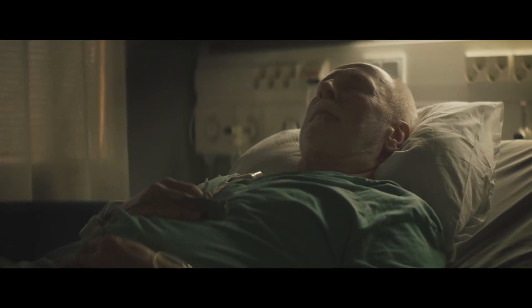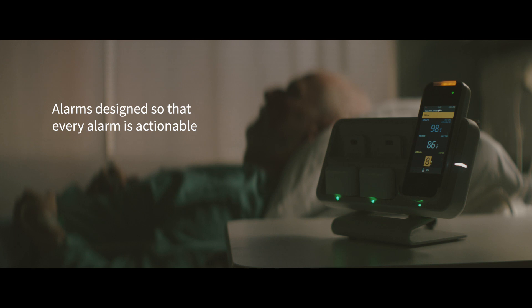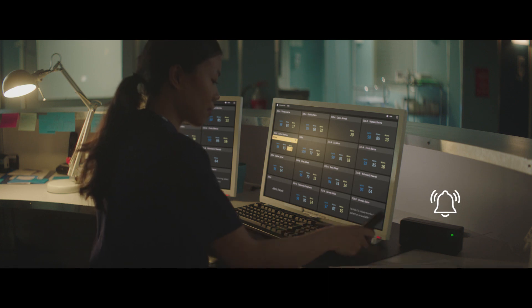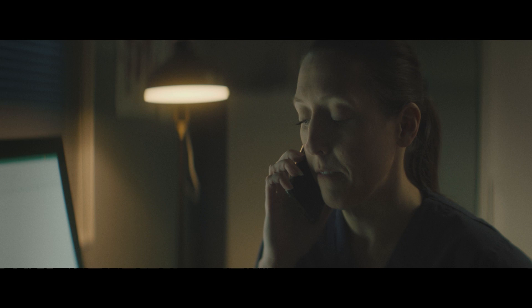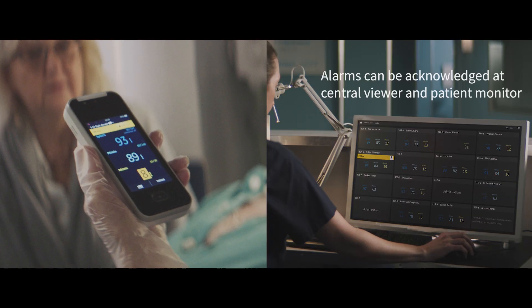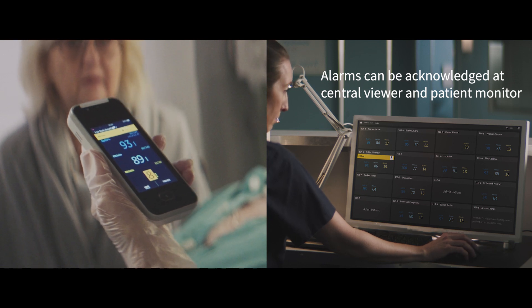While a clinician may notice a change in the patient's trend and intervene proactively, should a parameter exceed the alarm limit, an alarm will be triggered both visually and audibly. Caregivers have the option to configure the system to support a silent patient room or to have local alarming at the patient monitor in addition to the central viewer. Regardless of the setting, alarms can be acknowledged at both the Portrait Central Viewer and the patient monitor.